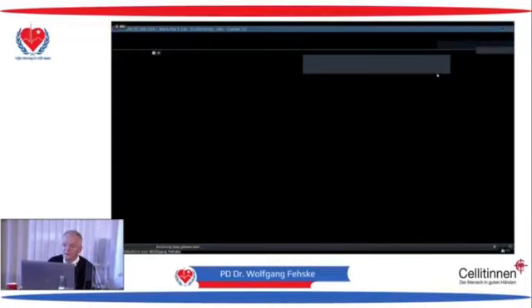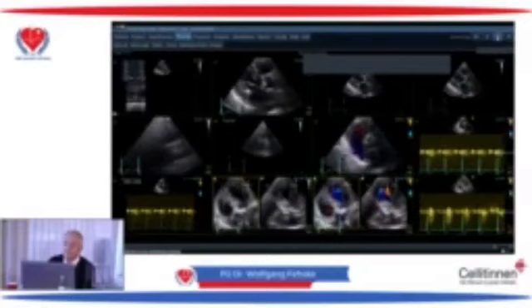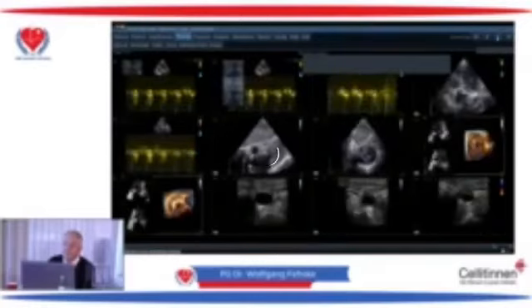Okay, so what we did then is TEE for that patient.